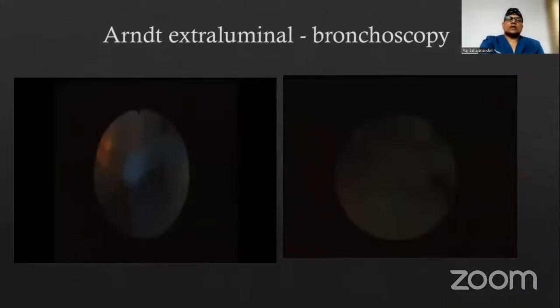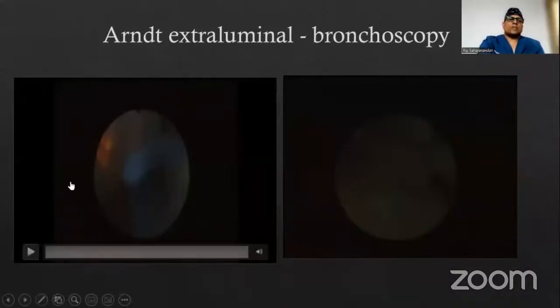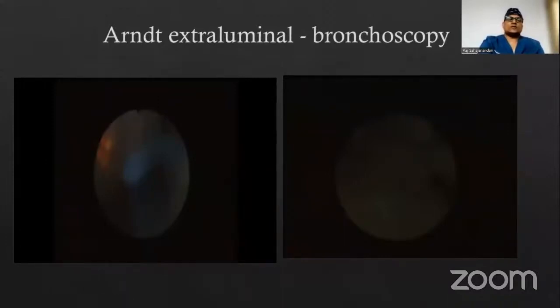I will just take the blocker, couple it with the fiber optic, do a laryngoscopy and introduce it. One technique we can use here is to railroad the appropriate size ET tube onto the fiber optic beforehand. I'll tell you why.